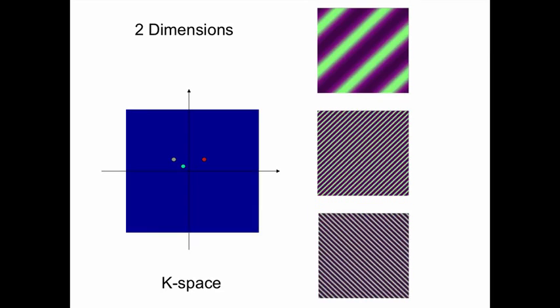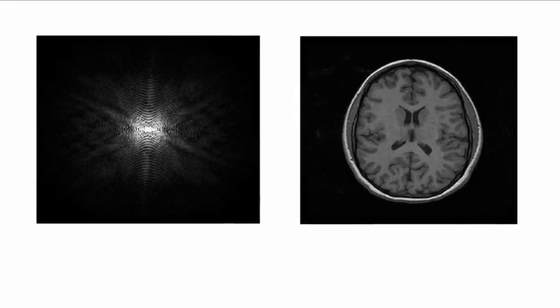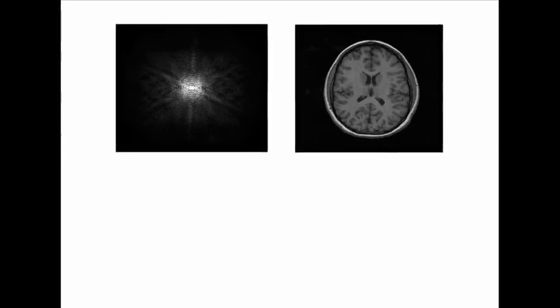So basically what we have in K-space is each point represents how much we should weigh a sinusoidal wave form like this. And it's the linear combination of all these sinusoidal wave forms weighted by their K-space measurement that gives us the image. Now that's kind of hard to believe when you see this K-space. So basically these K-space measurements are weighing these sinusoidal wave forms, and what I'm claiming here is that the weights of these K-space measurements will give us this beautiful image. And that can be a little difficult to believe at first view.